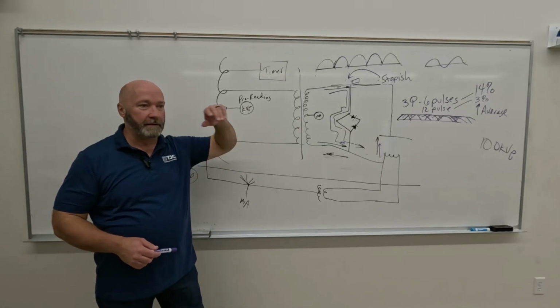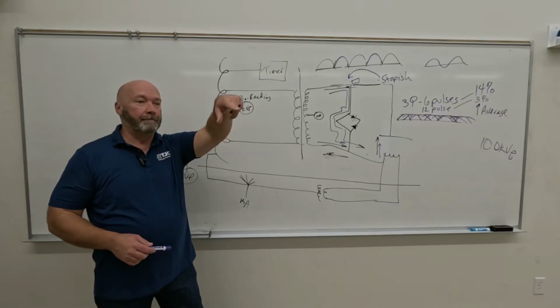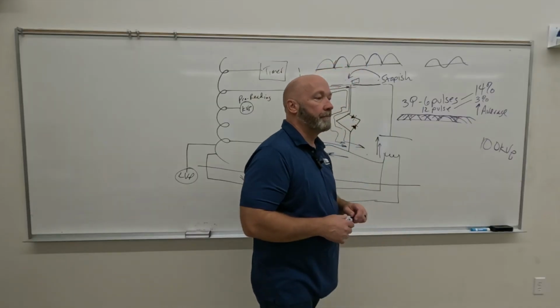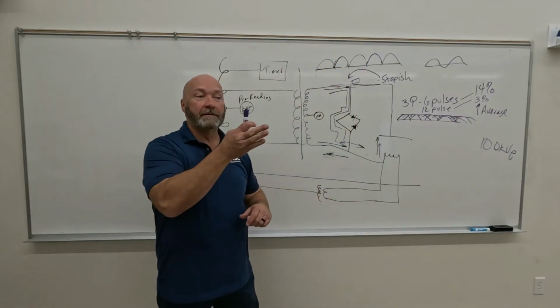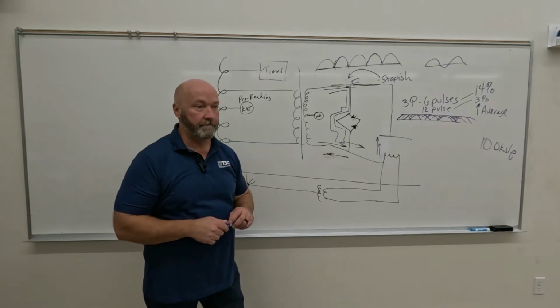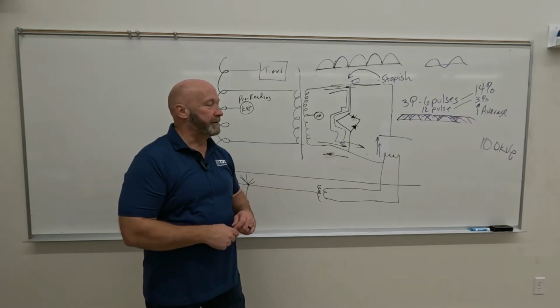Okay, so any questions on all that? Yep. So you're saying that pretty much all the X-ray tubes that we're using today are in three-phase? They're at least three-phase, probably high frequency. Yep, yep. It's wild too.